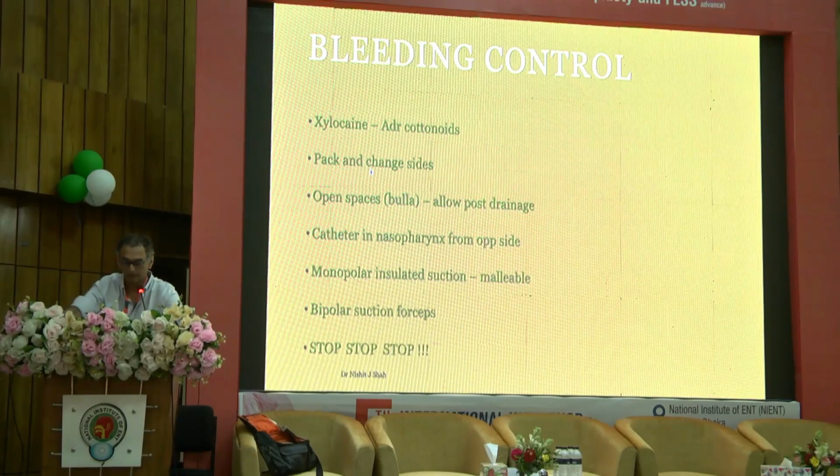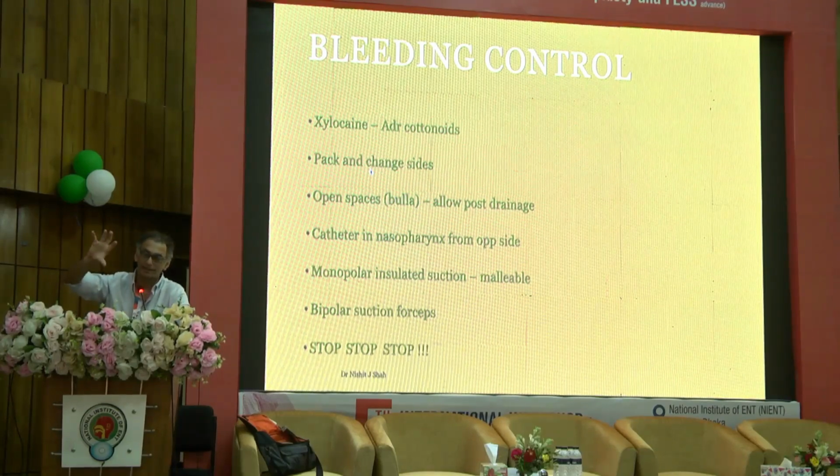Allow open spaces. So if you have, for example, an intact bulla technique and you're doing frontal and you have blood coming towards you, open the bulla so the blood can drain posteriorly.